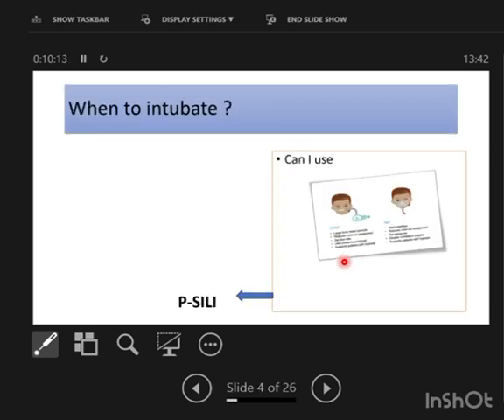Now in this patient, can I use NIV, high flow nasal cannula, or intubate? You got my question? So a septic patient with a respiratory rate of 24 to 38, with the upcoming evidence, what should I do? I give high oxygen, high flow nasal cannula, I use BiPAP, or I straight away go for invasive ventilation.